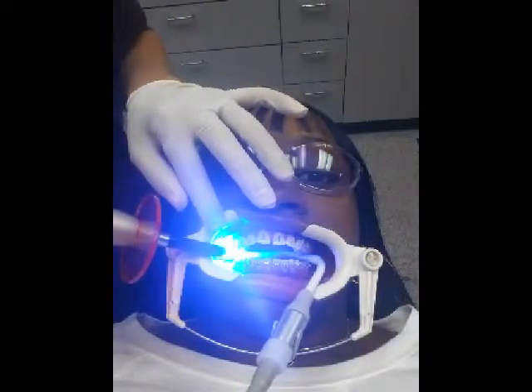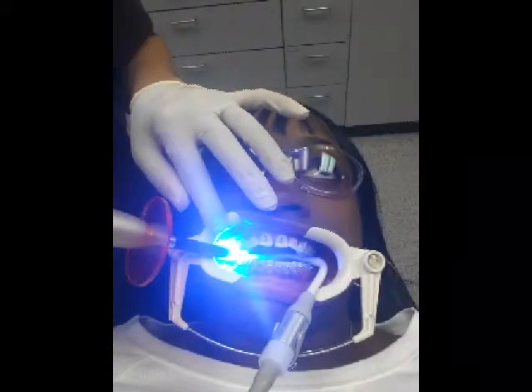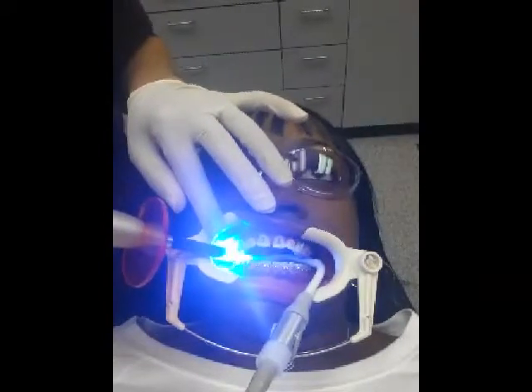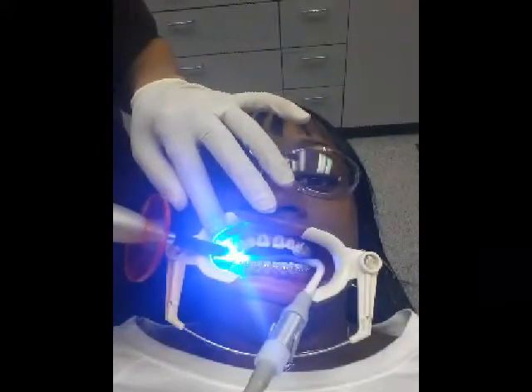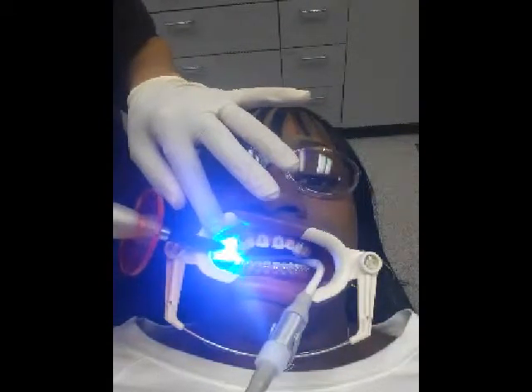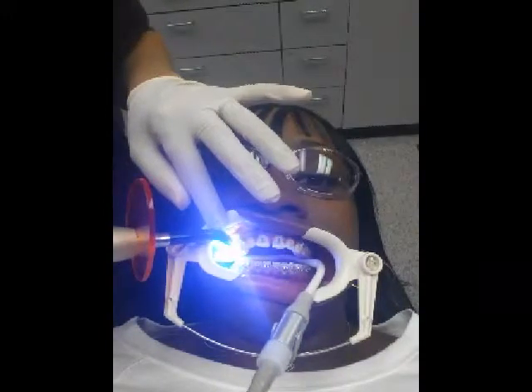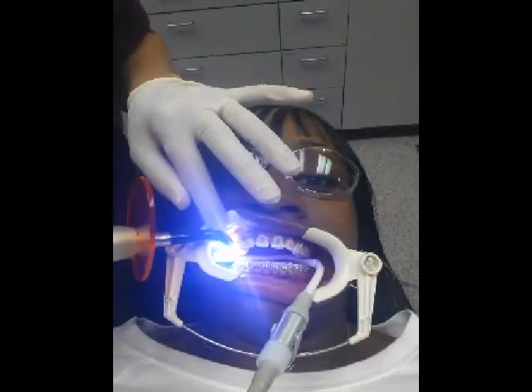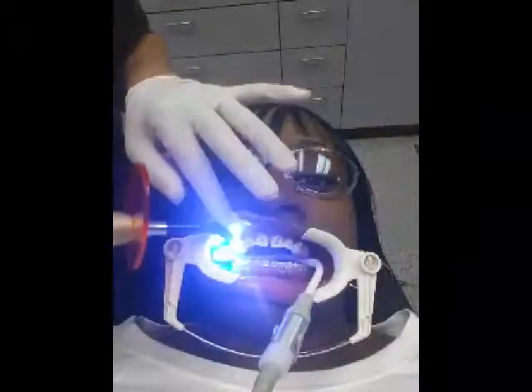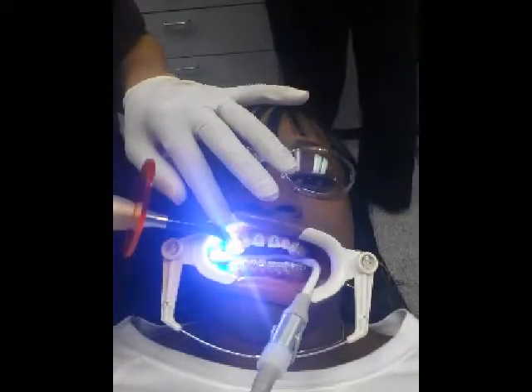Now, after she's placed each bracket and the orthodontist has come and made sure that the placement is correct, she just again takes that light and places it over each tooth individually and makes sure that the glue is hardened so that the brackets won't move. And I believe she went over each tooth twice. It seemed like she was doing that for a long time.